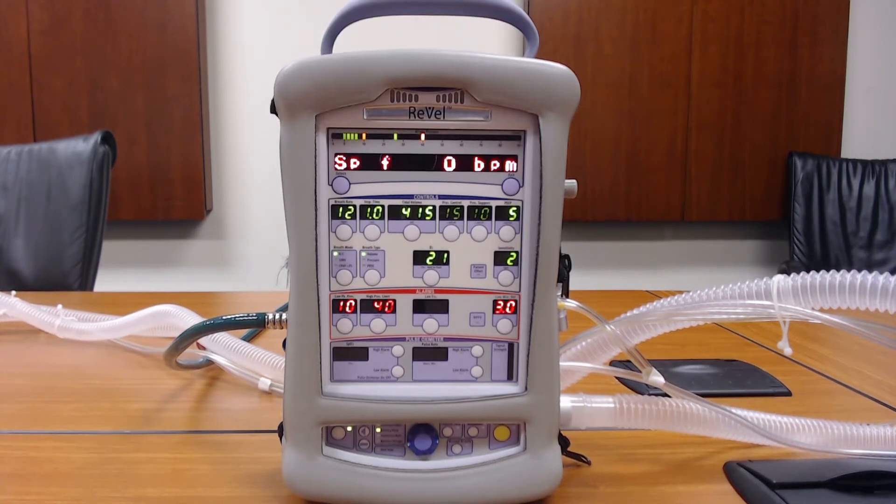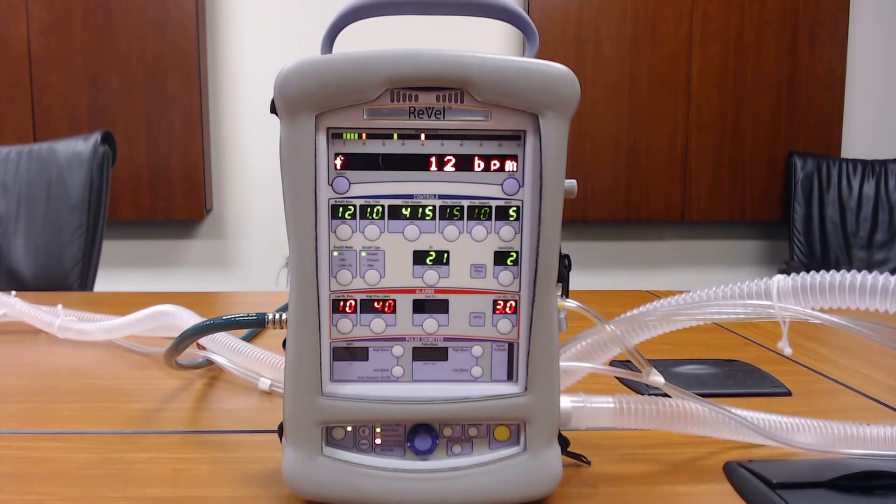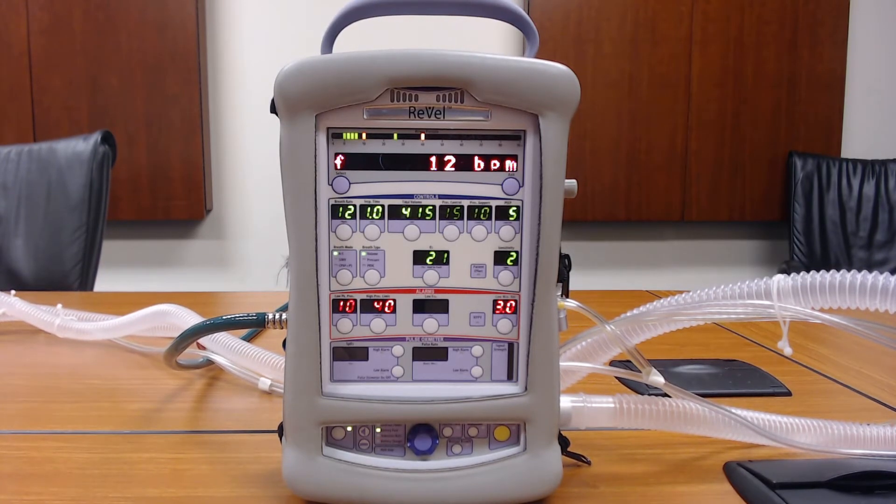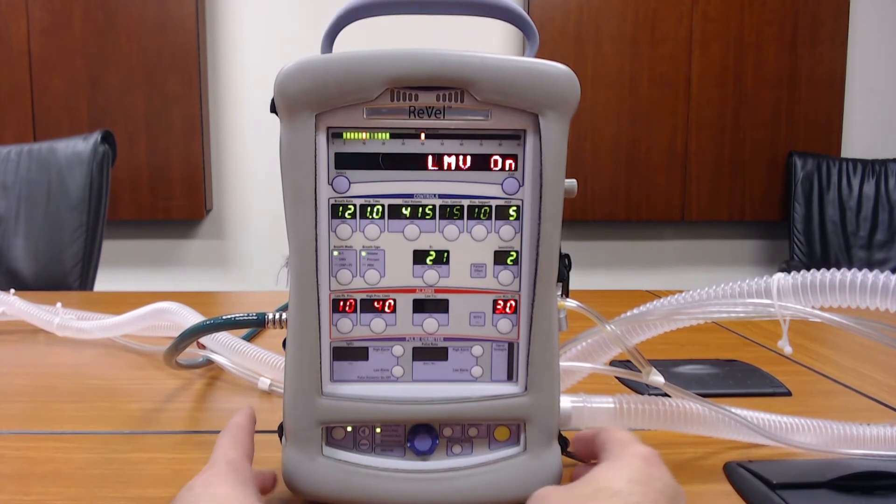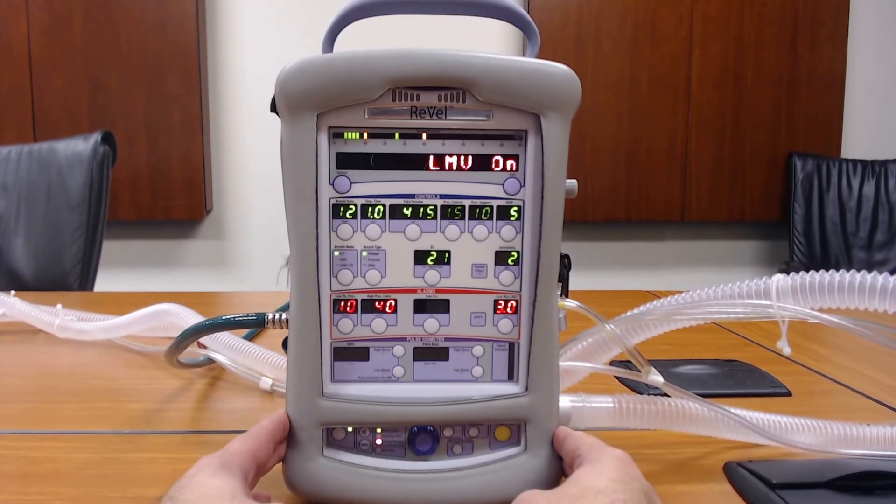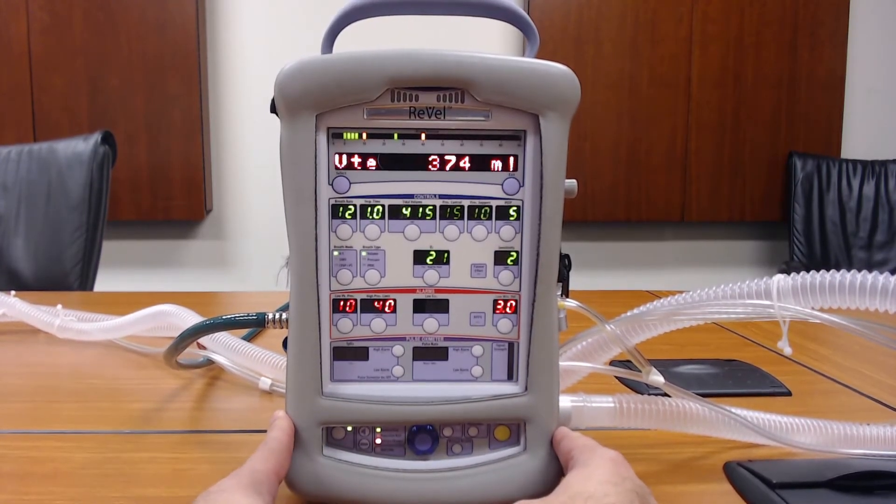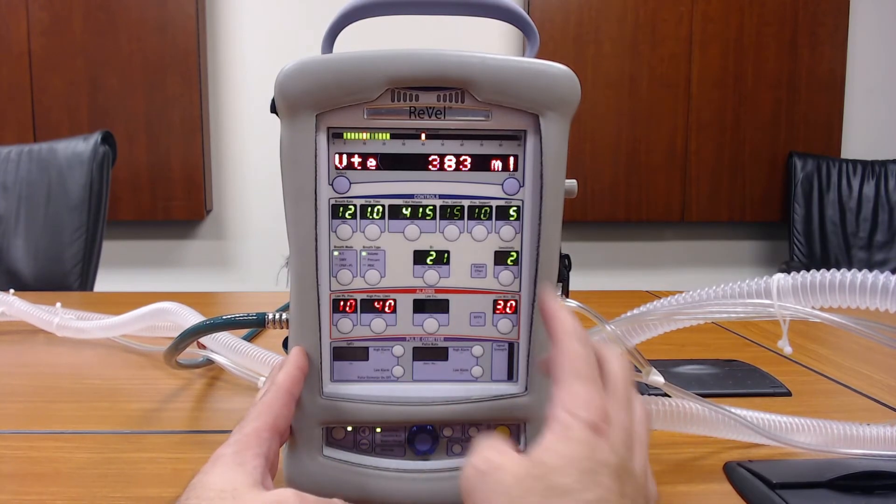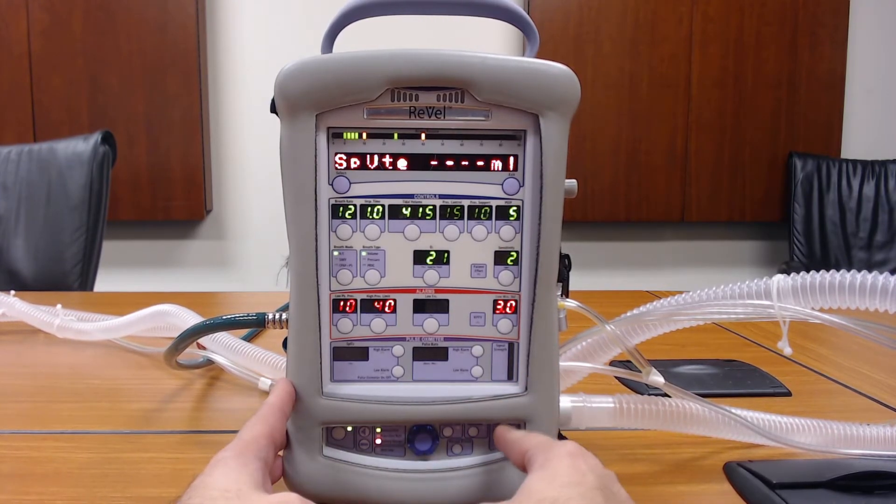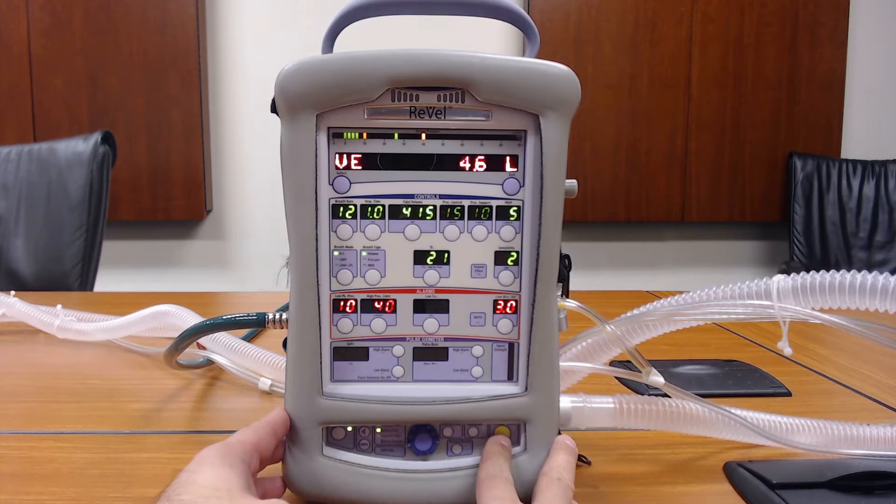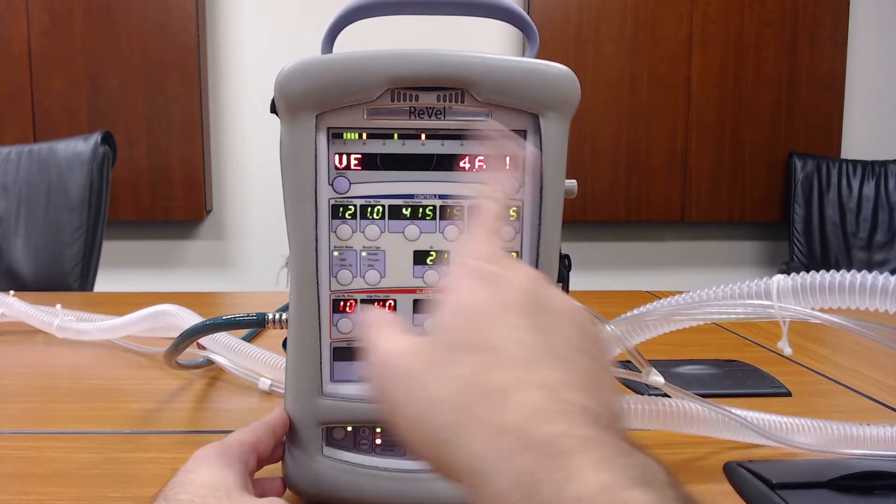To access the menus you need to have the vent on and operating in any of the breath modes. Make sure there's no alarms still up on the display screen. Hit the reset button to clear them out.